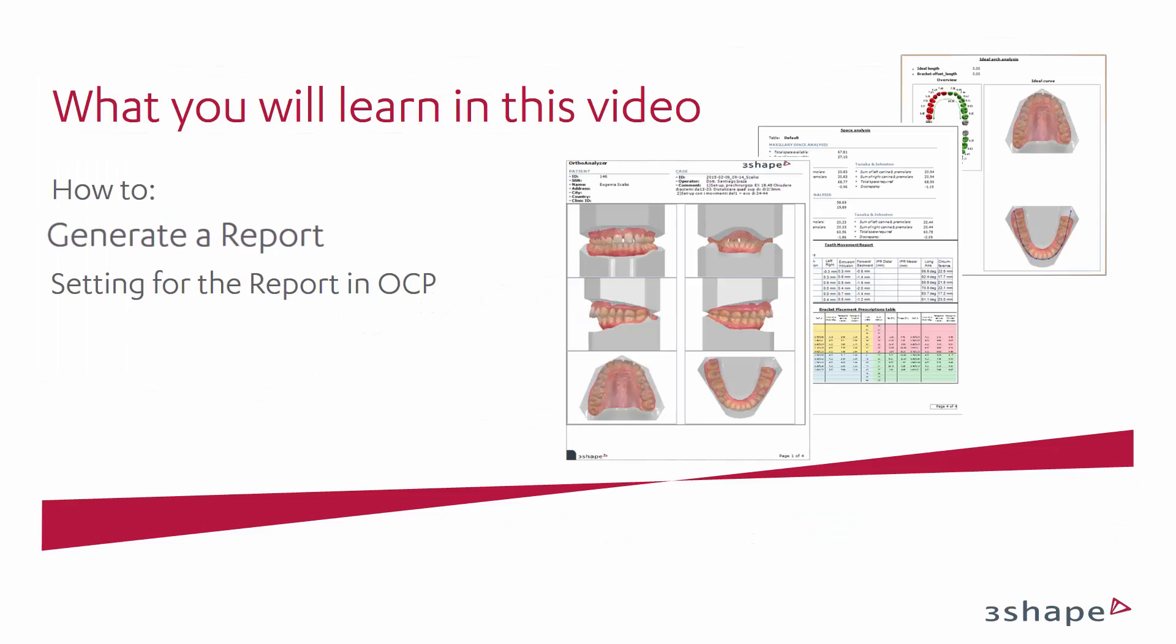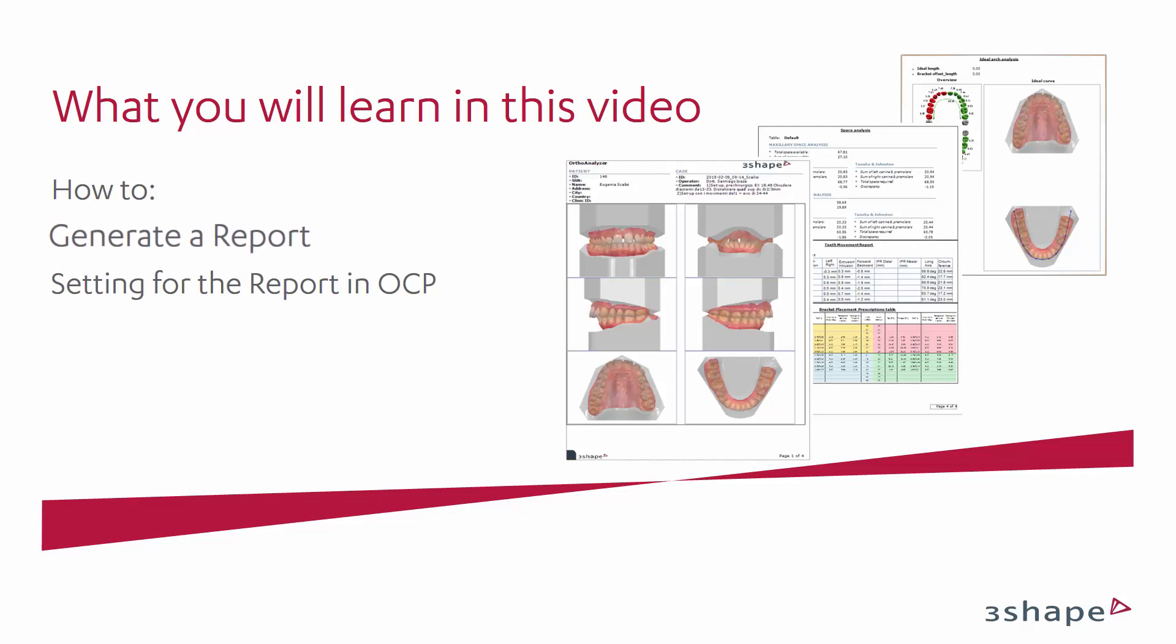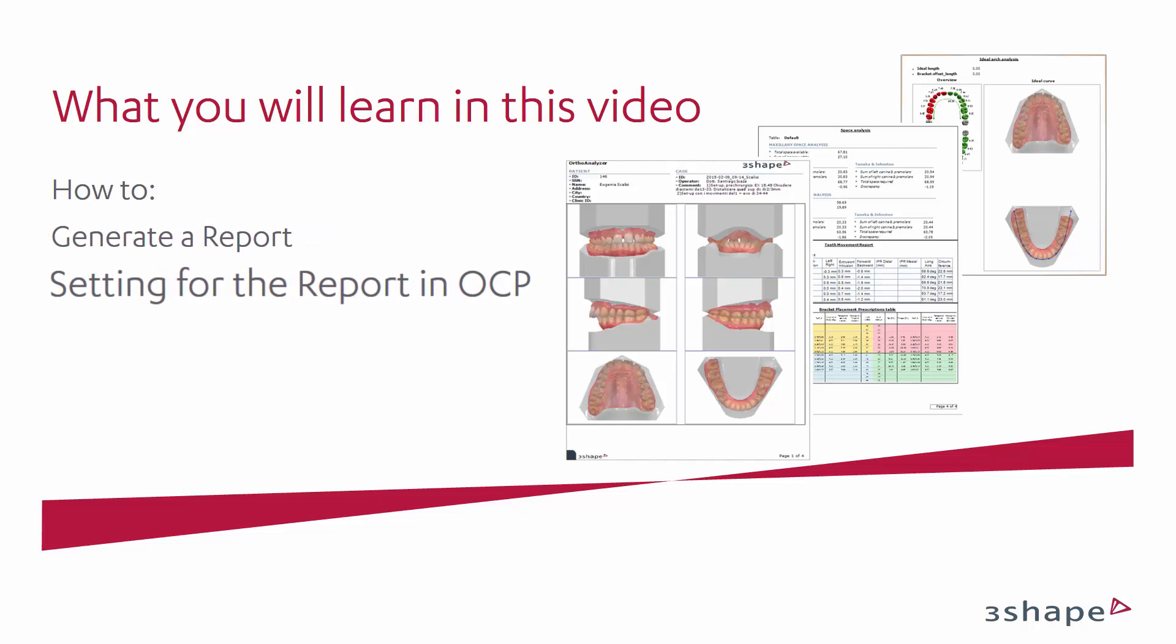In this video you will learn how to generate a report in OrthoAnalyzer and how to set it up in Ortho Control Panel.